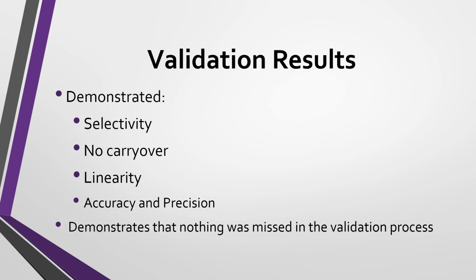There's no carryover; there is nothing that sticks in the machine after it is done to carry over into the next sample. You have linearity: the results, when you use spiked samples or calibration samples each at different levels, increase and form a line. That is important.